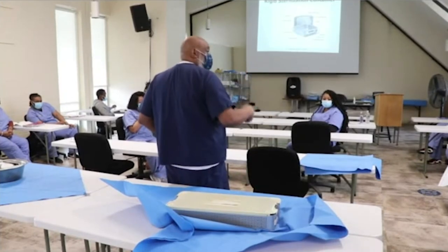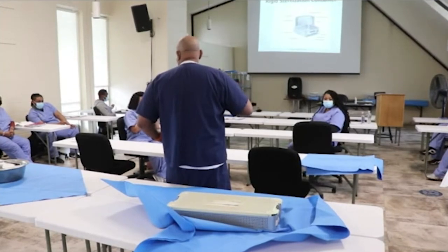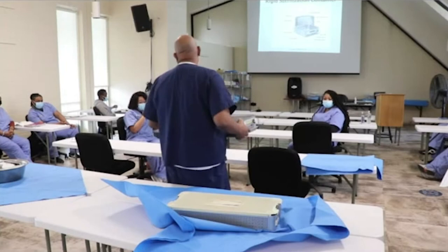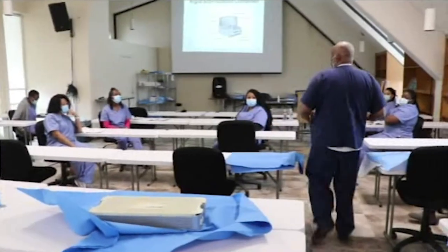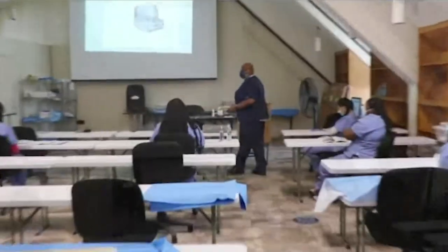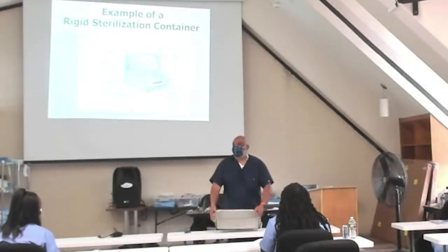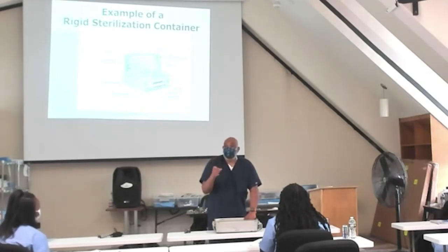Excellent. We always put the heavier on the bottom. Remember when we started assembling the trays, heavier instruments on the bottom? Same thing when you're loading your sterilizer, Shanique. Heavy trays always on the bottom. What we are charged to do as technicians is the balancing act, okay? Because we've got these rigid containers. This is you three. You're in prep and pack, right? You've got trays that have to be packed, and I've got 20 loaners that need to be wrapped, right? And your shift also has to do my 25 basins. So you've got wraps and you've got basins.